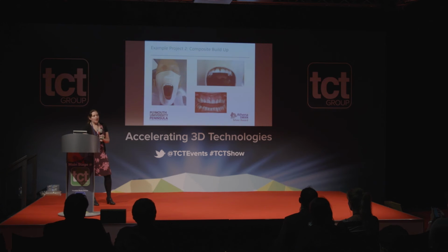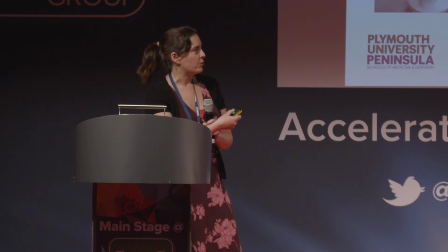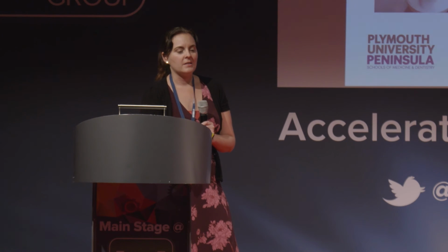The beauty of this is that the composite fillings that we use to build up the teeth are light cured resins, but just with fillers in. So they bond really well to other light cured resins, and it gives quite a realistic effect. Sometimes when the students are practicing and bonding the white fillings to the plastic teeth, they don't really bond very well and the fillings tend to fall off. But they actually bond really well to other light cured resins. So you get quite a good finish with this, and it's worked out quite well as an exercise.